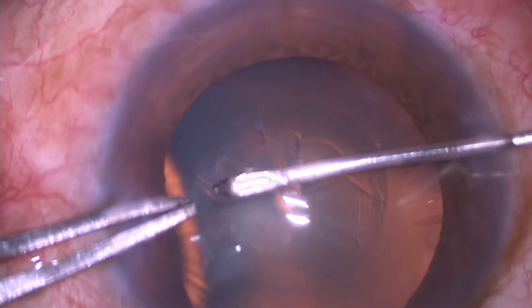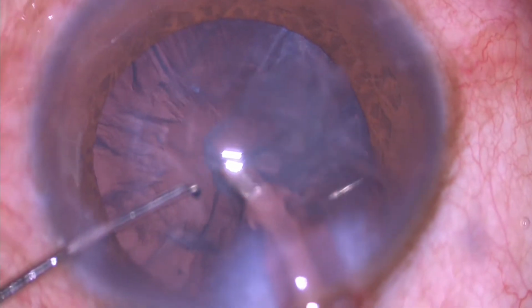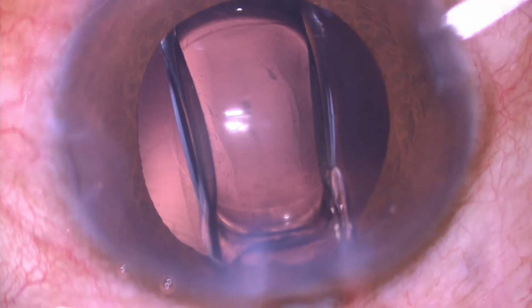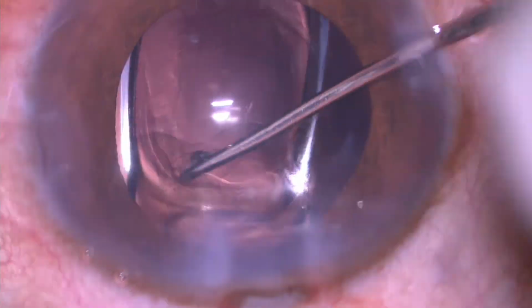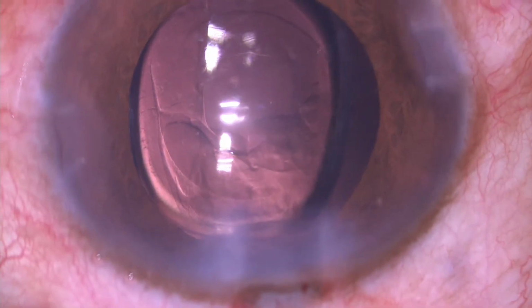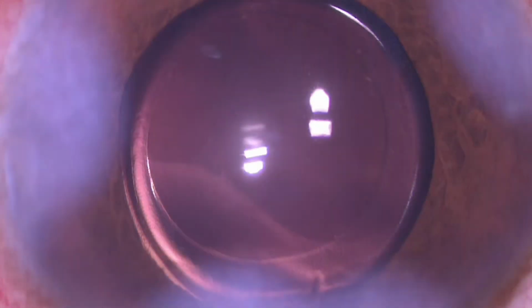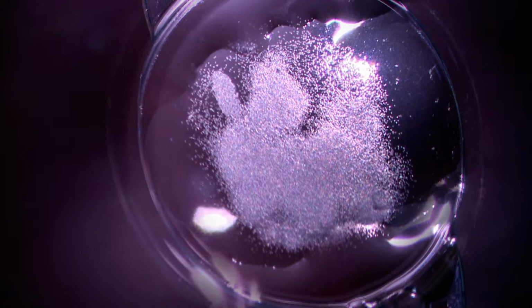In recent times, phacoemulsification of cataractous lens followed by intraocular lens implantation results in excellent visual acuity. However, in certain situations, IOL turns opaque, resulting in visual disturbances.